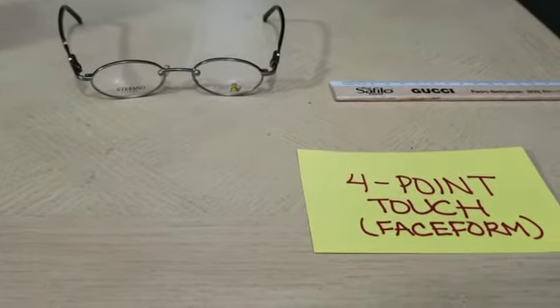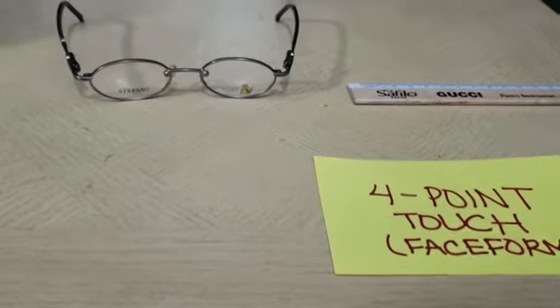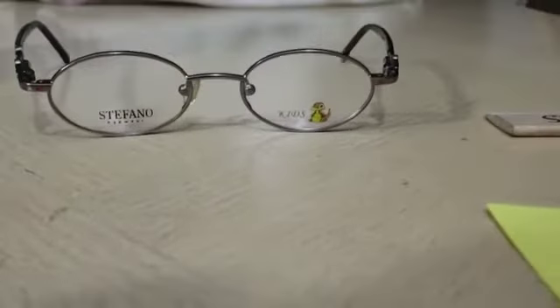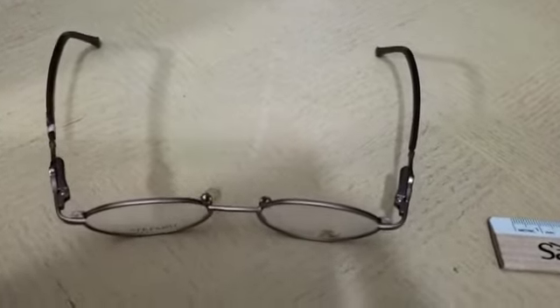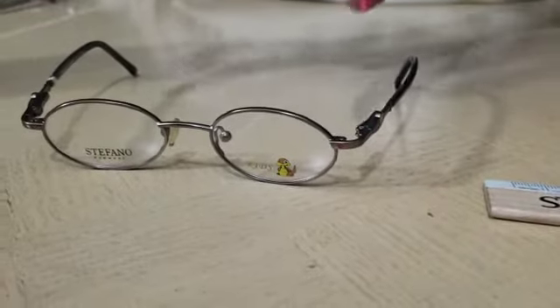This alignment is called four-point touch face form. The lens I have is a negative face form because the frames protrude outward temporally. You would use a PD ruler so that you can see that it is protruding outwards.